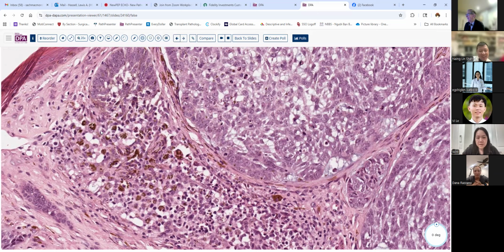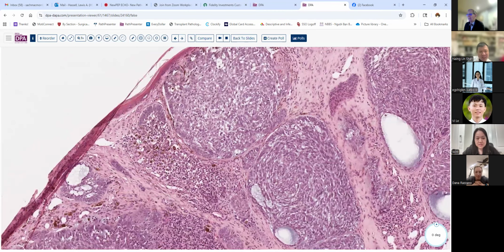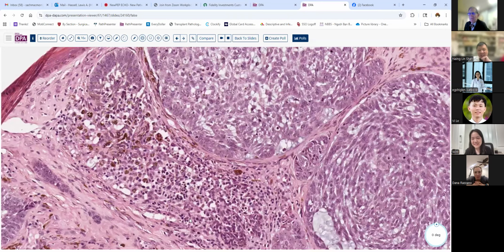It's a melanin pigment, and some are like melanophages. Yeah, exactly. Thank you. So this is a pigmented lesion. Clinically, it looked black. It had lots of dark pigment in it. So I'm going to take the control back here. How can I give it back to you? Just leave your mouse alone, and it will let me move. Okay, there we go.